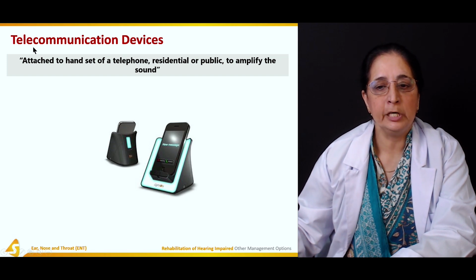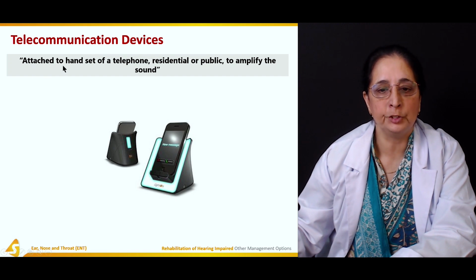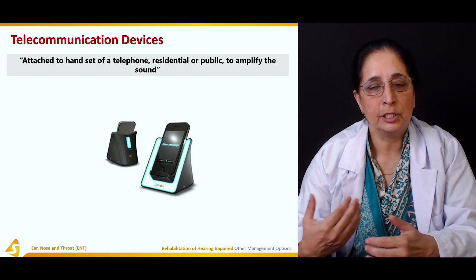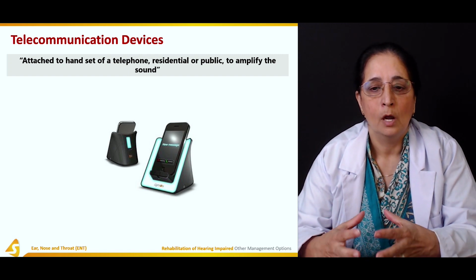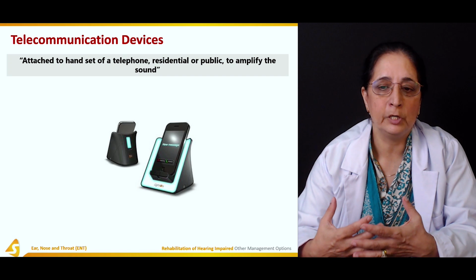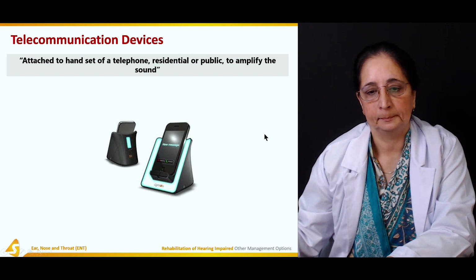Then telecommunication devices. Telecommunication devices are attached to the handset of a telephone, residential or public, to amplify the sound so the individual can hear better. These are known as telecommunication devices. They are attached to telephone sets.